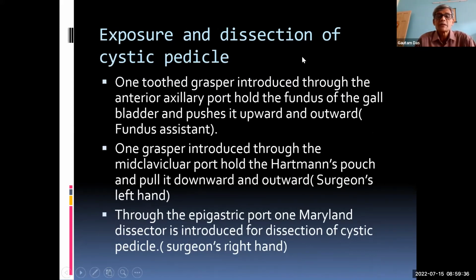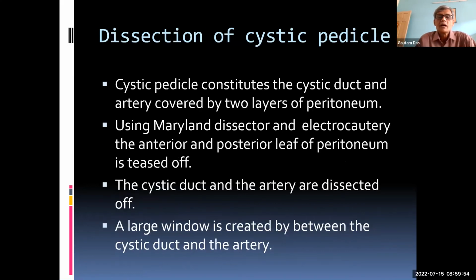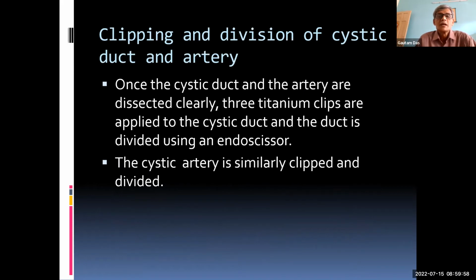Now you have mentioned what the steps are. You have mentioned correctly, and you have to pull the gallbladder downward and outward to the left with your left hand to make the triangle a square, and you can get a diagonal with the cystic artery. Now we have mentioned all these things.